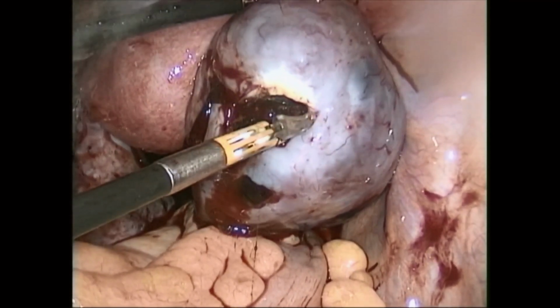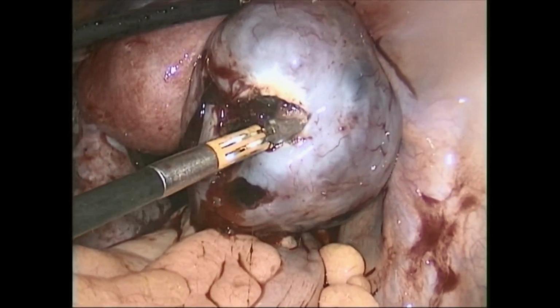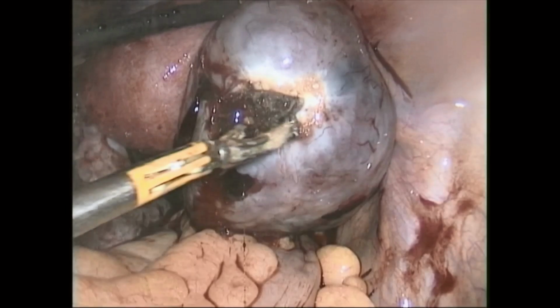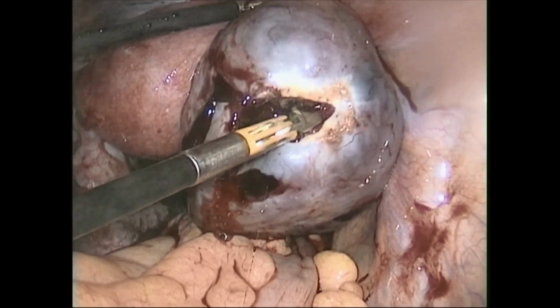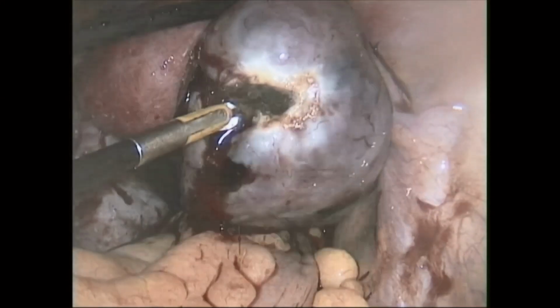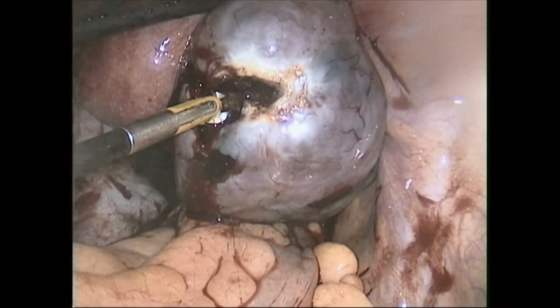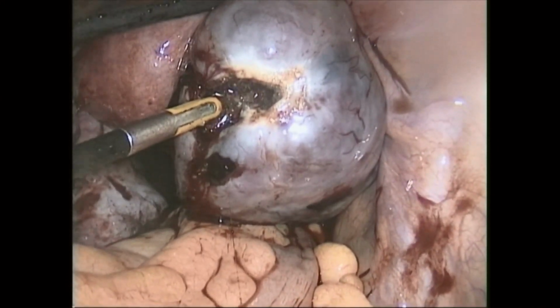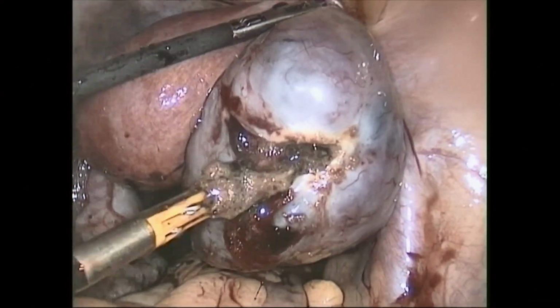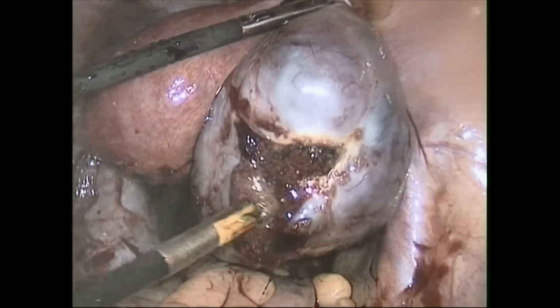Now see, it is very difficult to coagulate, because there is not a single point which is bleeding. The large defect is oozing, so you need to form a crust over it. You need to have patience, because by doing this you will save the ovary. Otherwise you may end up doing an oophorectomy.